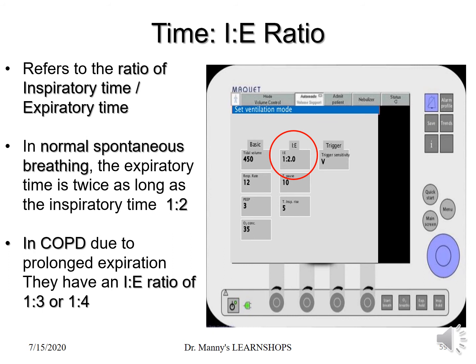In COPD patients, chronic obstructive pulmonary disease patients, they have a prolonged expiratory time typically, and it can be anywhere between 1 to 3, 1 to 4 or 1 to 5. So it's important to be aware of that as the person setting up the ventilator or their settings.